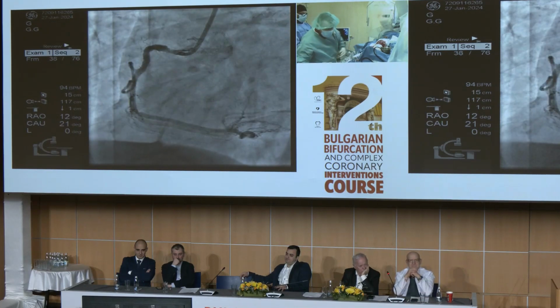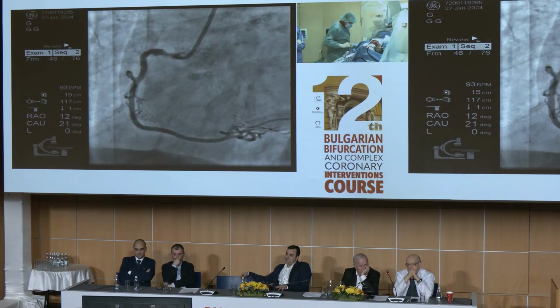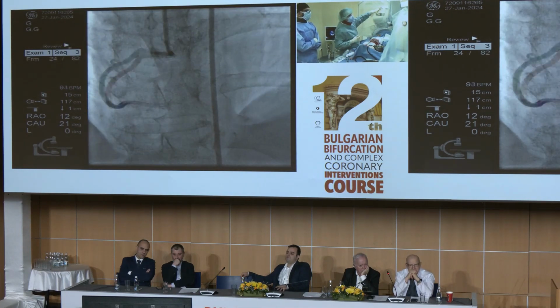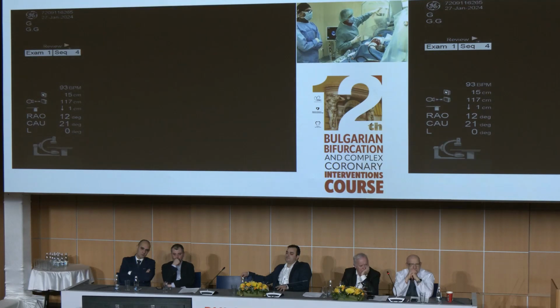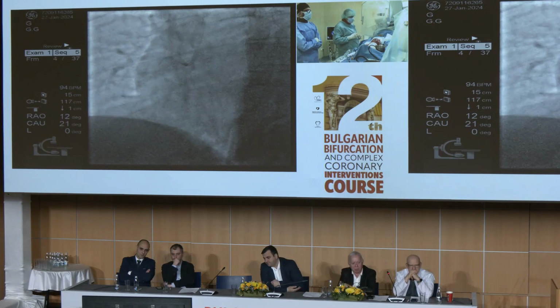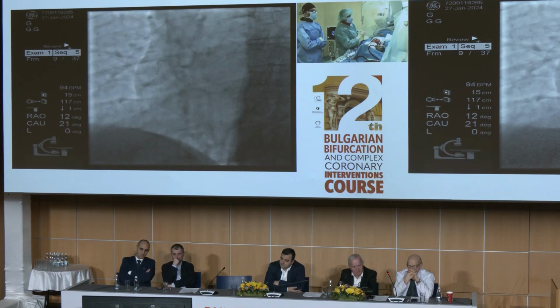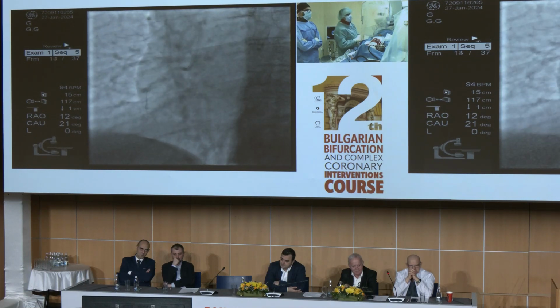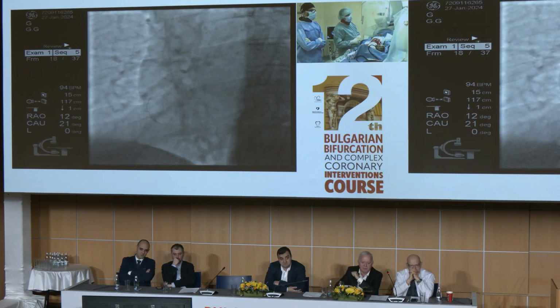seems borderline significant, and that was the reason that we made several projections, but this did not make the situation more clear. And this is why, as we discussed before, we made a non-hyperemic assessment for this lesion. And the RFR at this point, the lowest RFR at this point, was 0.97, 0.98.